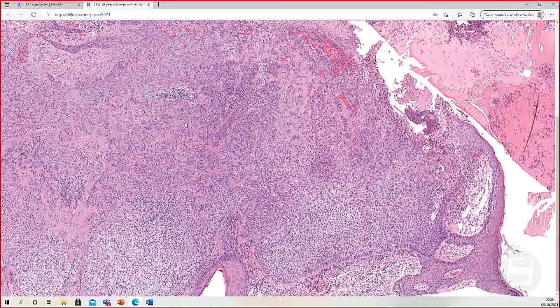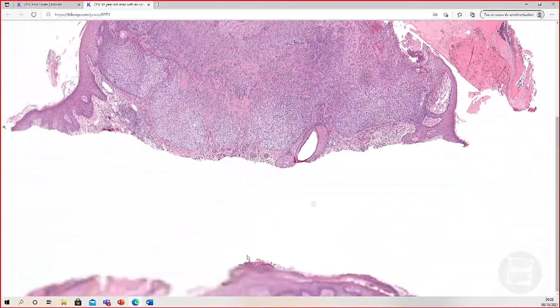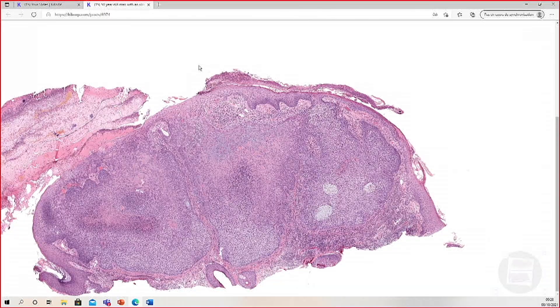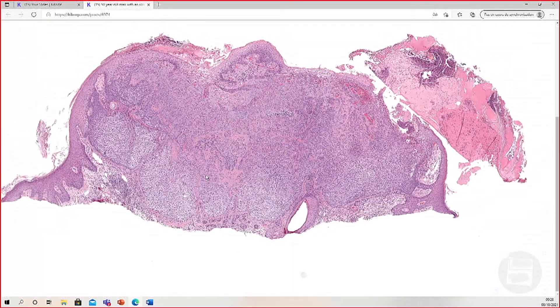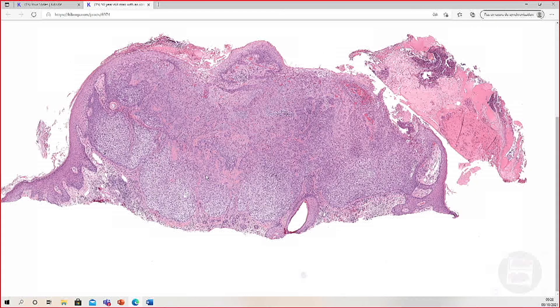This is a desmoplastic trichilemmoma. You can just diagnose this as trichilemmoma — the 'desmoplastic' designation is a pattern for pathologists to recognize so that you don't mistakenly confuse it with carcinoma. This is a good diagnosis to know because it may spare someone a larger surgery they don't need. These often occur on the nose or cheek, and could result in Mohs surgery or a larger excision if misdiagnosed as carcinoma.